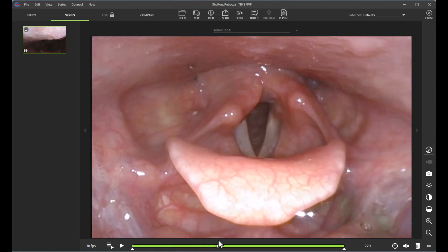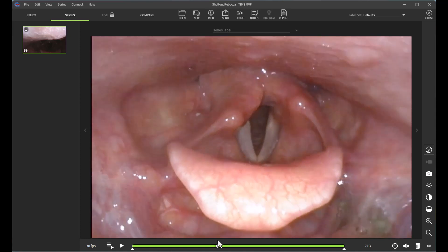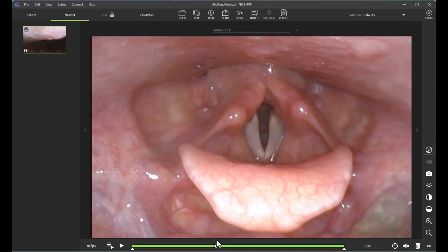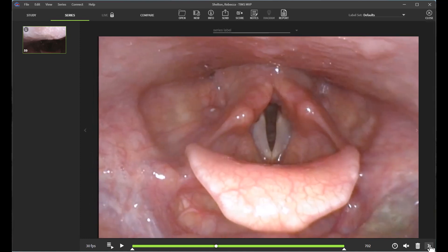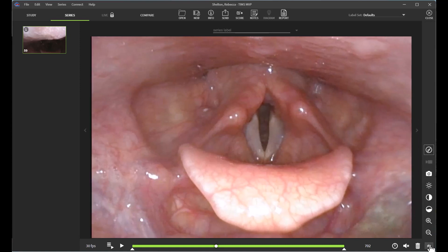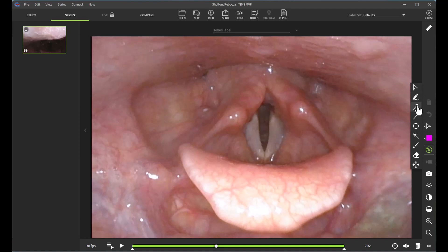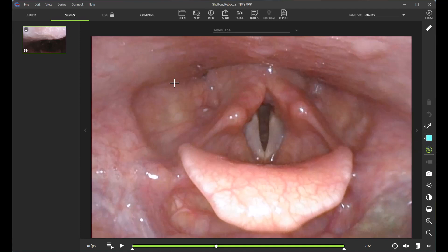Let's say that there's something that I'm wanting to point out on this study. I can add telestrations by opening my toolbar here on the right-hand side, and then selecting which tool I'm wanting to use. I'm going to go ahead and add in an arrow and change the color to blue.